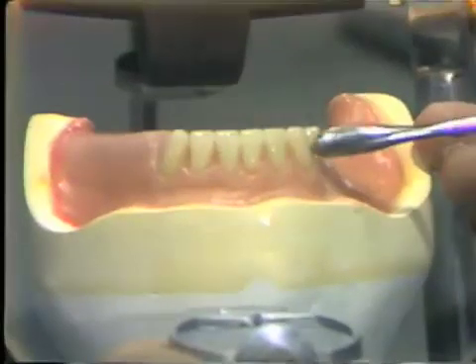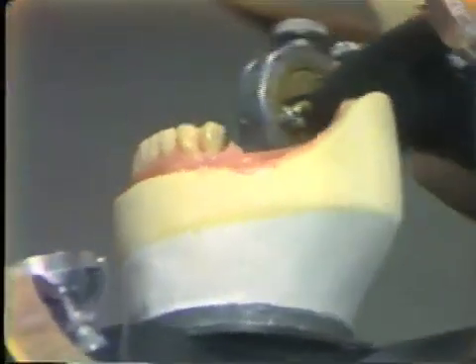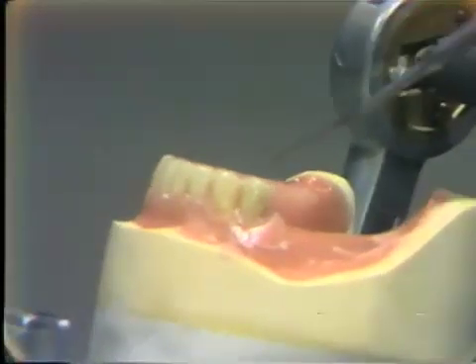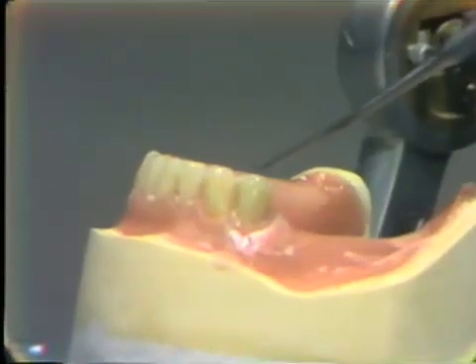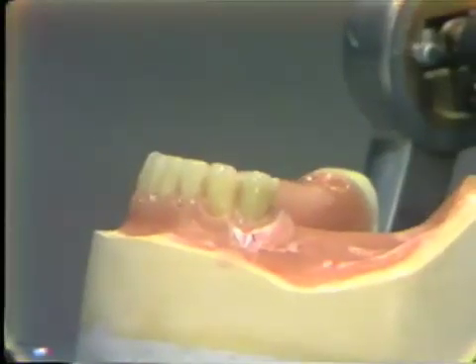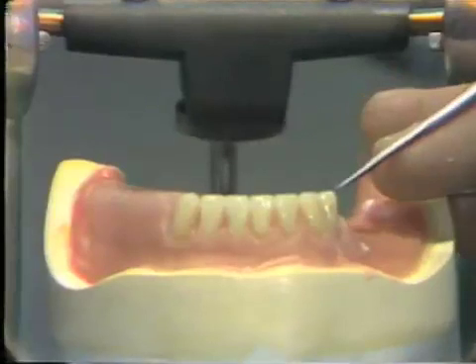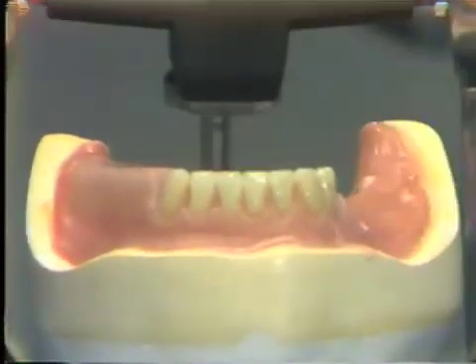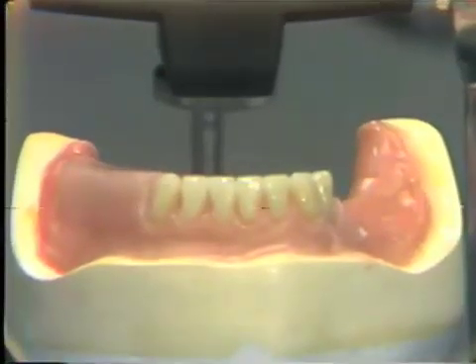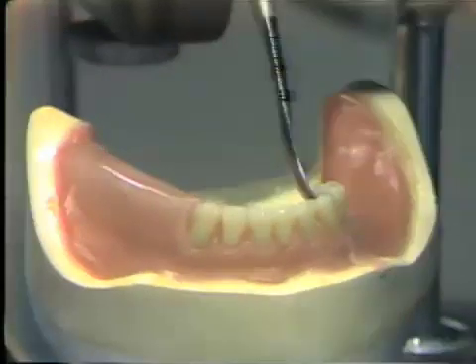We can seal the tooth and look at it from the buccal to see its relationship with the tentative occlusal plane. With the tooth in position, you will notice that as we proceed posteriorly we have the beginning of our compensating curve. The occlusal surface of this tooth should be flat, and then beginning with the molar we will start the incline to the compensating curve. In the frontal view, the buccal cusp is a little bit more prominent than the lingual cusp. This is the proper position for the bicuspid. Now I'm going to seal that and then set the first molar.